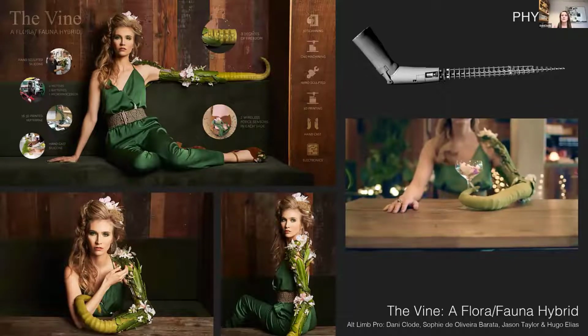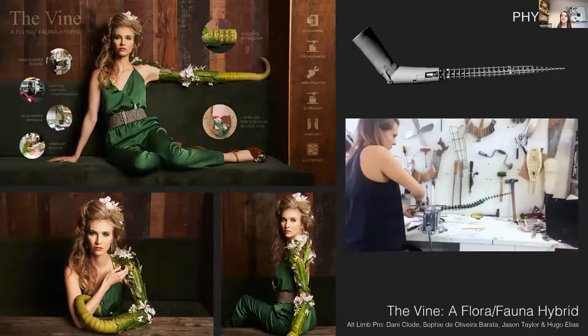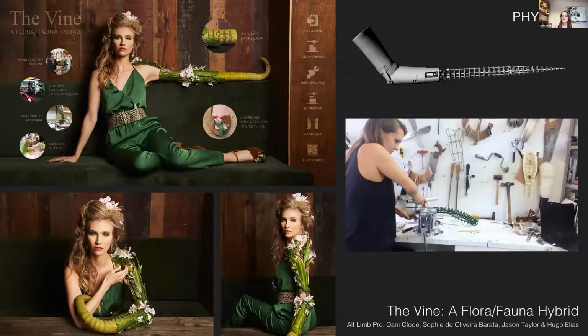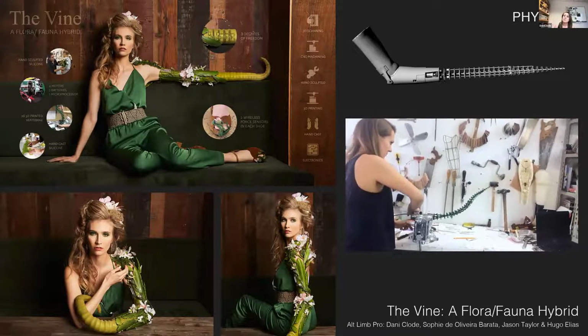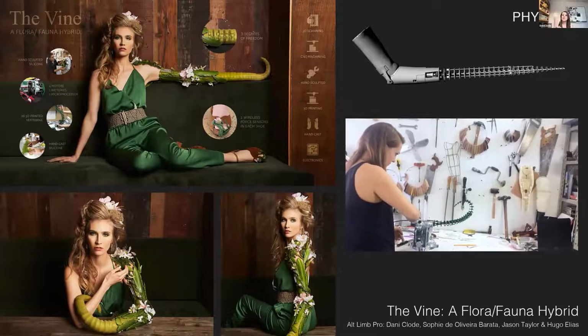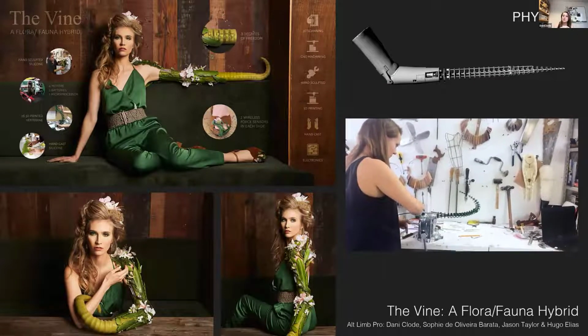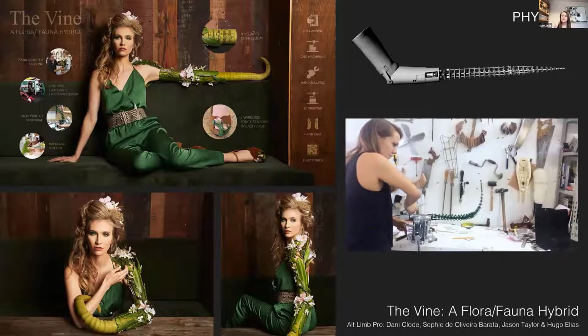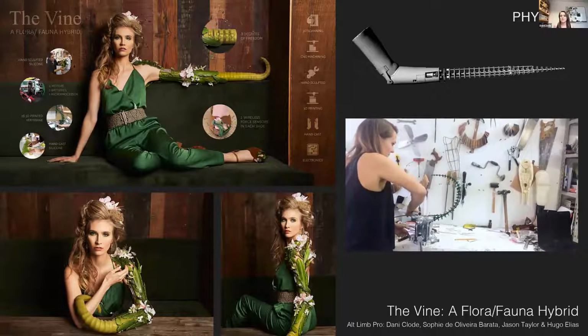So the vine is made up of 26 individual vertebrae that are controlled by 4 pressure sensors embedded in Kelly's shoes, situated above and below her big toes. The piece is wireless and motor controlled with 3 main parts. The socket houses the end of Kelly's arm, as well as the motors and batteries. Above that is a botanical armored piece that helps to distribute the weight of the vine, and then the vertebrae come out of the end of the socket.